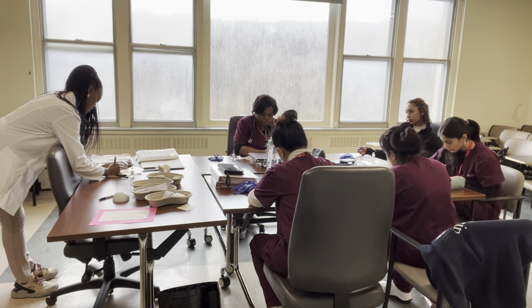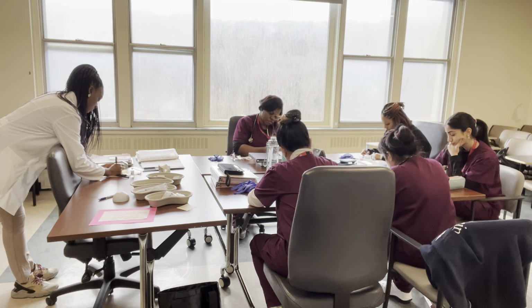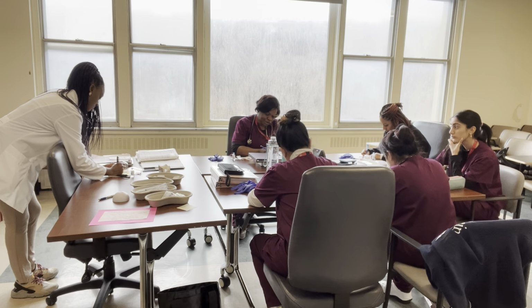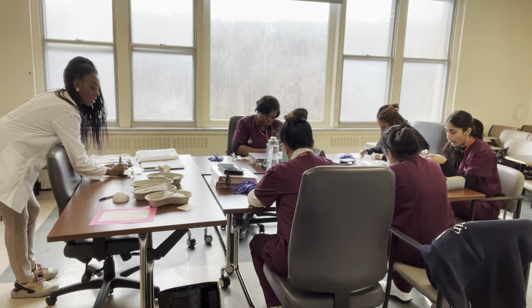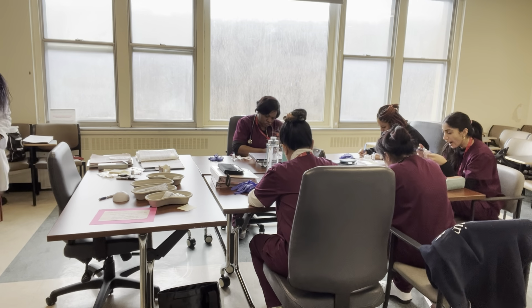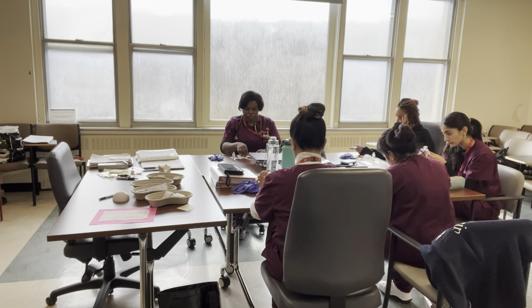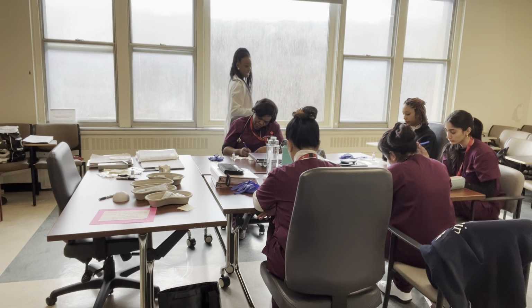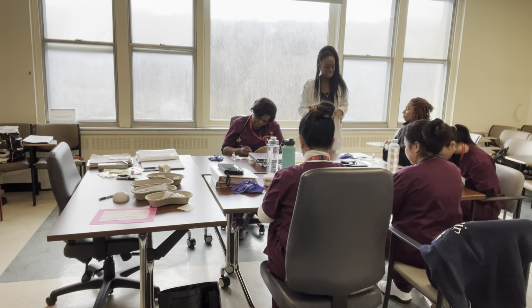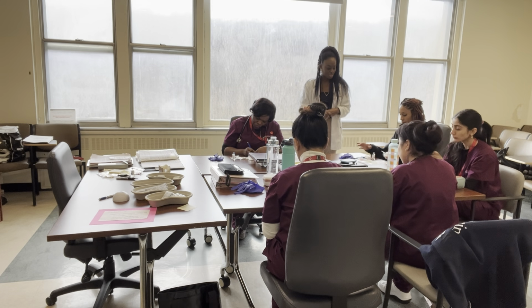For you, Mademoiselle Crystal, your patient had 7 units of Humalog. And then for Madame Bolani, your patient had, I'll say, 11 units of Humalog. Okay, so you can prepare your patient for the administration. If you have any questions, make sure that you understand how to do it. Afterwards, when you have a patient with insulin, you'll be able to inject it into your client. Same process, okay?